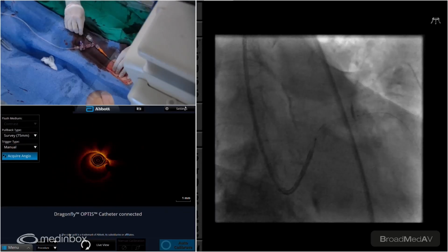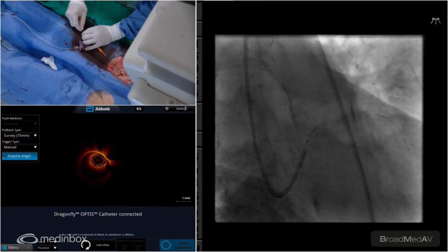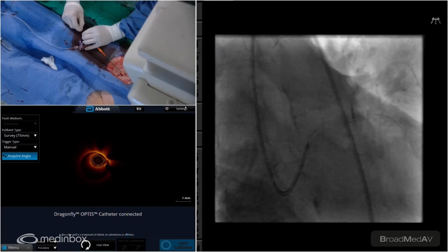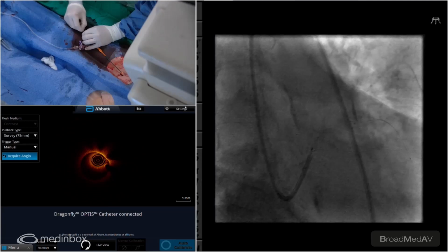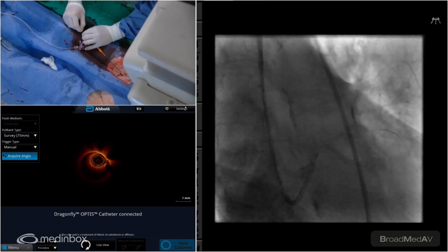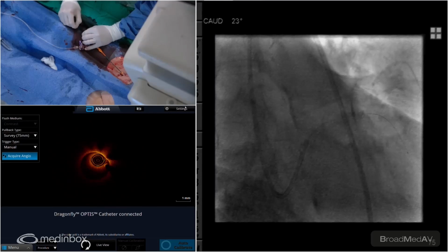So the LAD, we don't appreciate in some of our angio pictures, tortuosity. Yeah, it comes off at an acute angle off the left main. So maybe that's why we can't get this thing across. I don't want to belabor the point. I think we should just do rota.